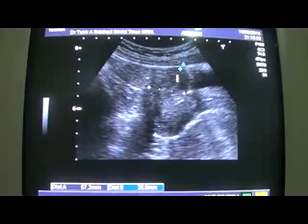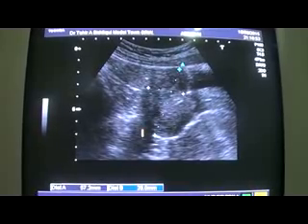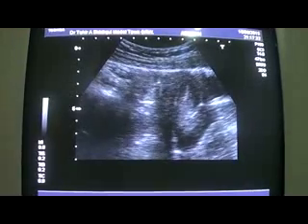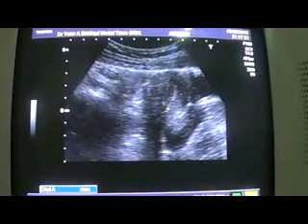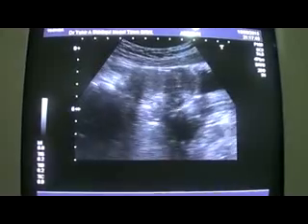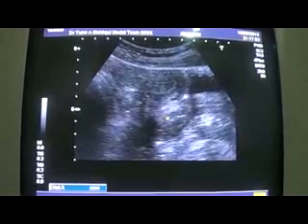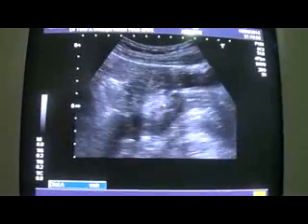This is the endometrial canal, this area. This is the urinary bladder, this is the cervix, and this is the vagina. We are seeing it in this position because the bladder is inadequately filled. Because of her pain, she cannot retain the urine. The endometrial canal measures 8.4 millimeters, is clear, and is central. This area is the cervix, and this is the vagina. This line is the cervix.